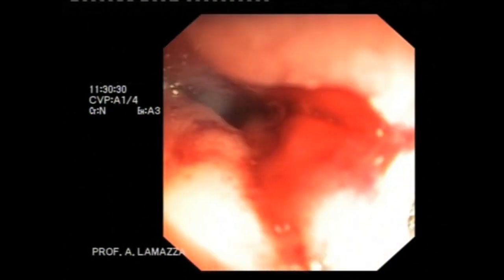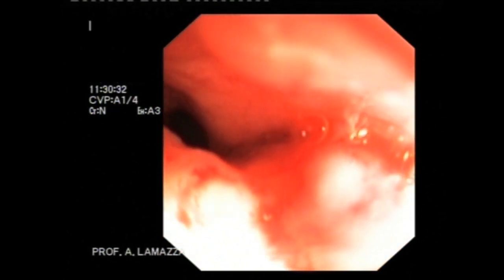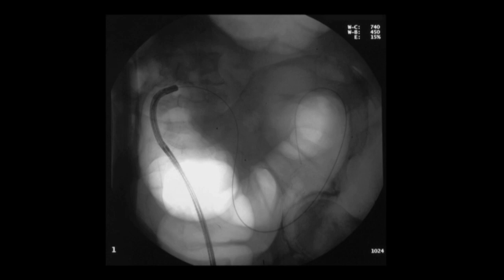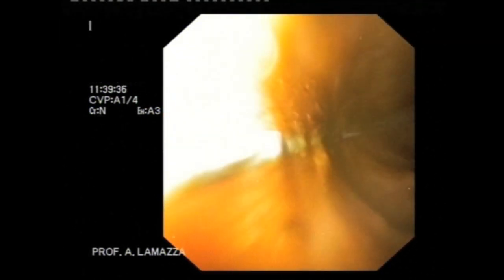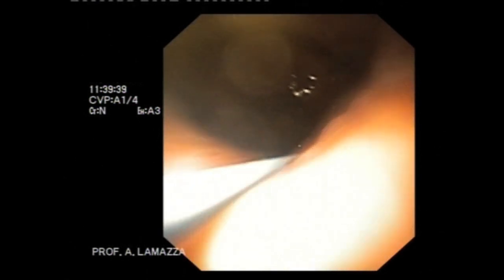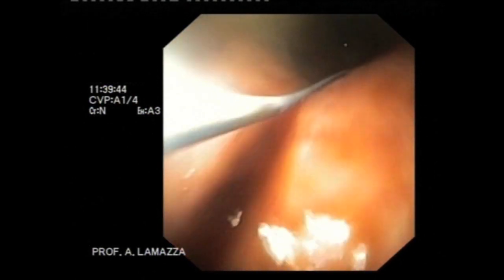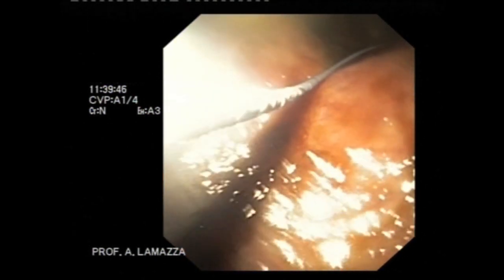The thin pediatric nasogastroscope is advanced through the colorectal stenosis, well above the stenosis for at least 30 cm. The guide wire is inserted through the nasogastroscope and its advancement is followed visually, in order to avoid lesions to the colonic wall, which above the obstruction is usually dilated and partially ischemic.